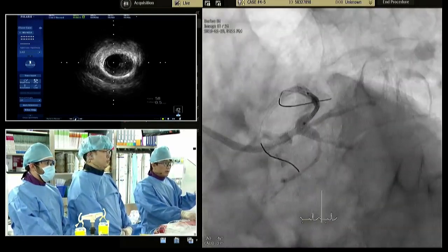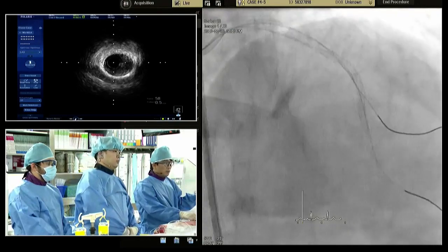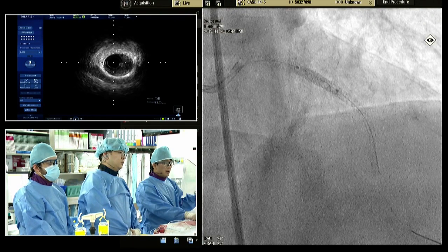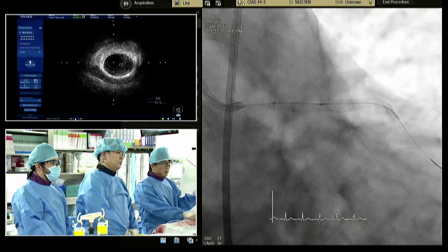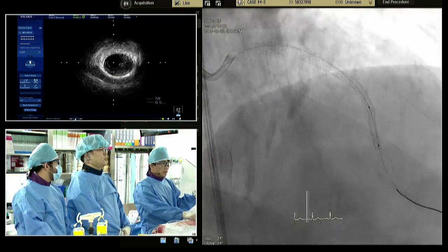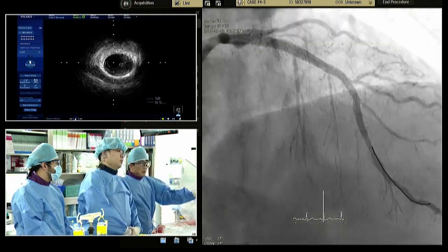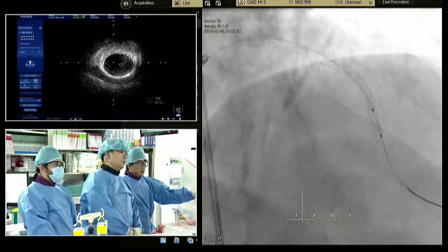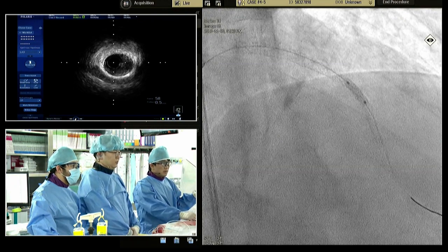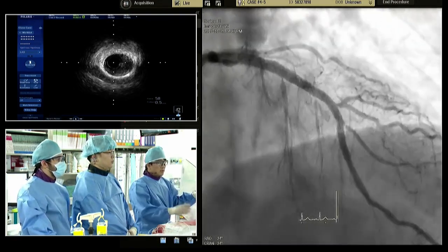And after identifying the appropriate position right here, I stented it, 3.5, and hopefully the branches are okay. So I applied the 3.75 high pressure balloon at the proximal and the mid, like this. And I applied the 3.0 high pressure balloon at the distal to mid, like this. So this is the result. And I applied a little bit more high pressure because I was finding there was a little bit of under expansion there, like this. And actually this is the final angiogram.